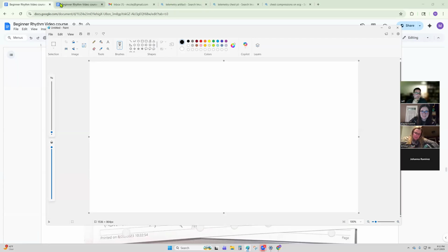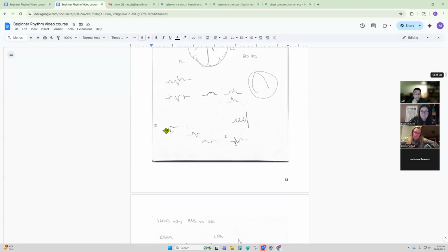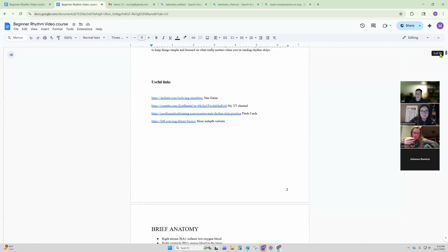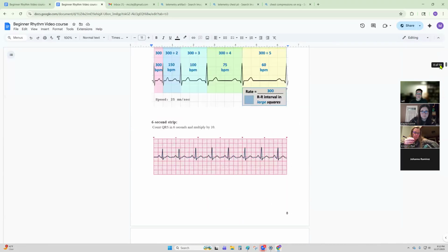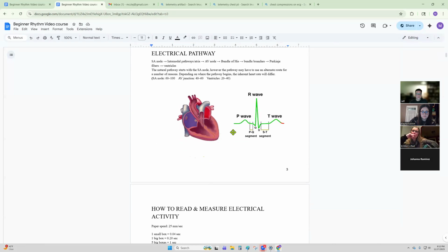So let me find, multifocal coming from multiple foci, right? Yes. It comes in many forms. So I'm getting a little ahead of myself, and I want to talk about bundle branches first before I continue on with this.